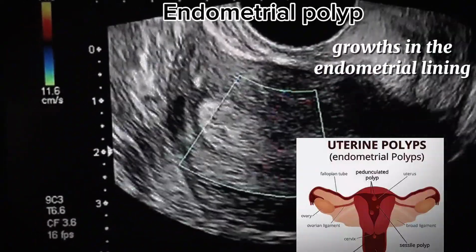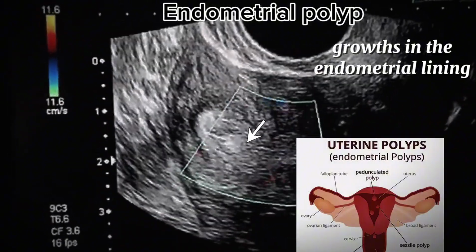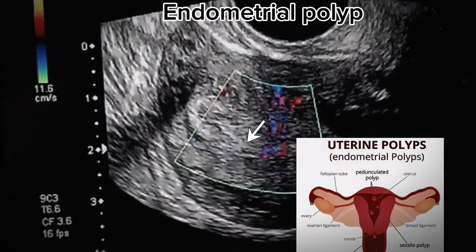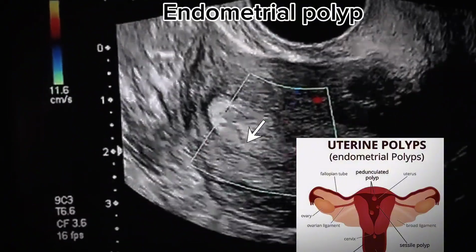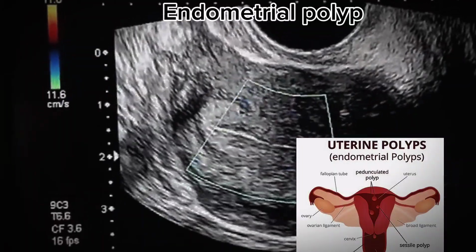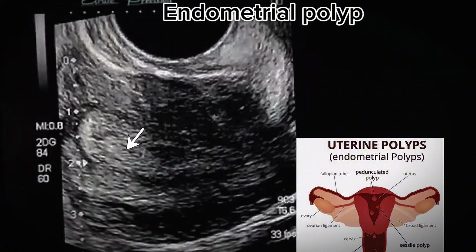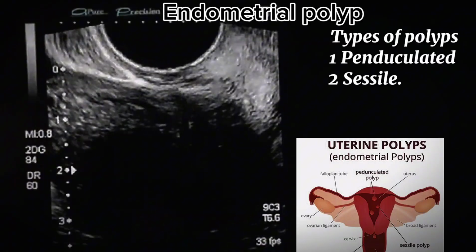Endometrial polyps are growths within the endometrial lining of uterus, and they can be identified through ultrasound, particularly through transvaginal ultrasound. Features of polyps are they appear as hyperechoic masses which are well defined, round or oval, lying within the endometrial cavity. Endometrial thickening may be visualized at the place where polyp is located. Some polyps may also contain small cystic areas.